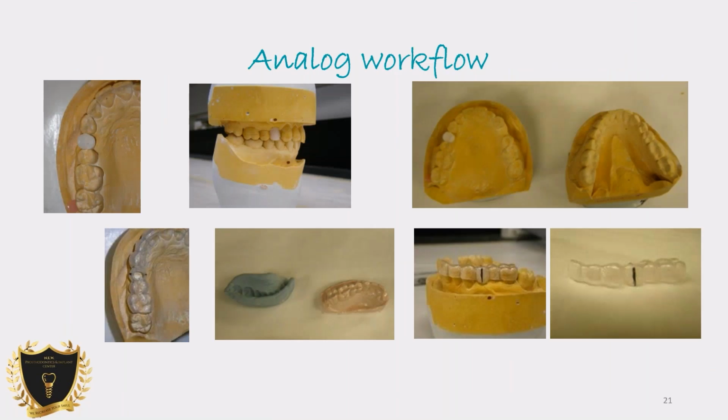I've been practicing for close to 25 years, so of course I started my career in the world of plaster. If you are still one of those practitioners using alginates and VPS, doing freehand and talking to the lab, most of the labs are digital. This is the old school way of doing it. You make an impression, pour it up, do a wax up, do a suck down, draw a line, put the hole in the middle, and give it to the surgeon to place an implant.